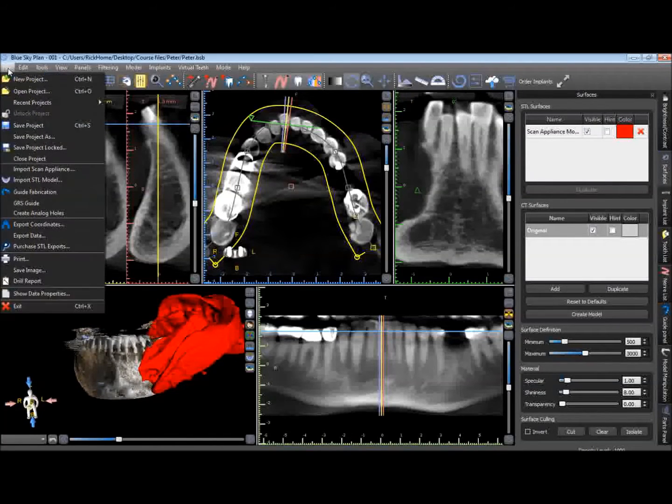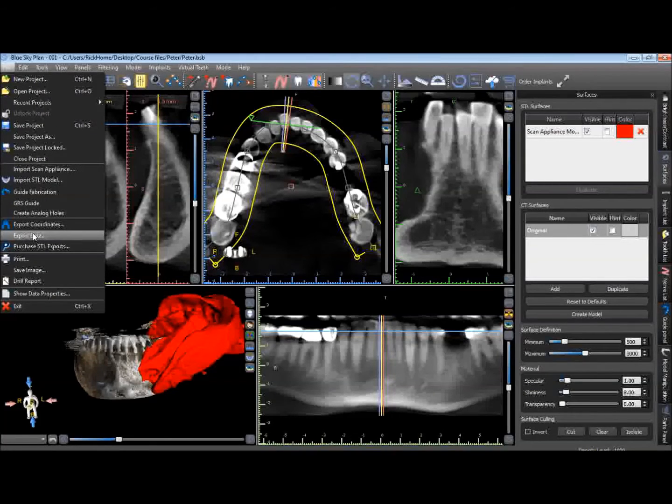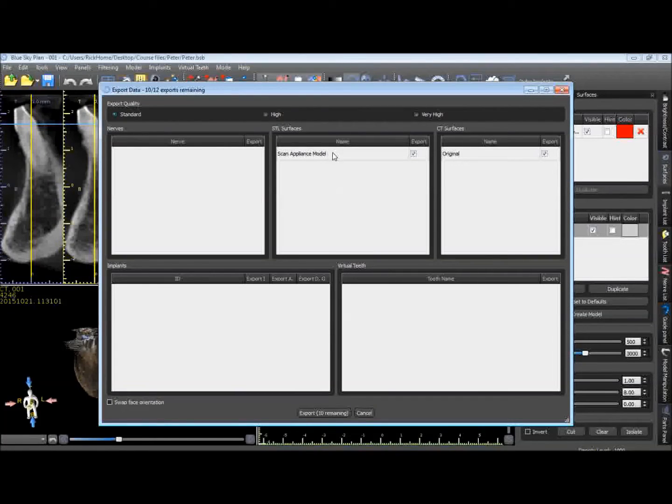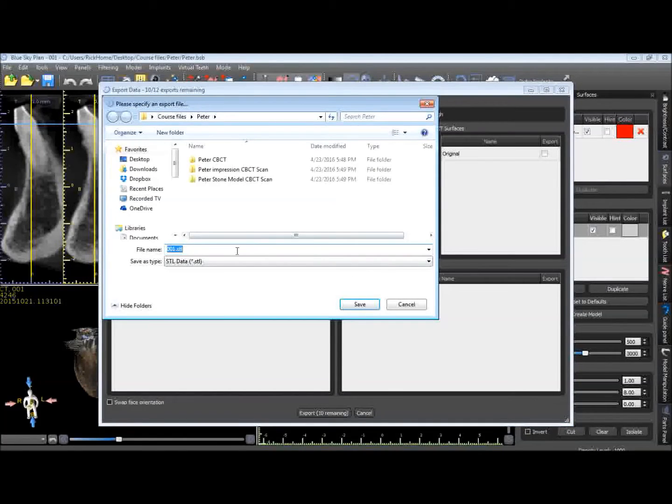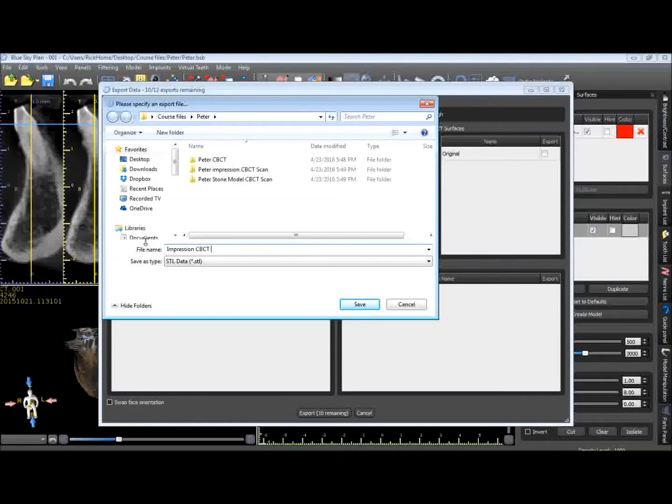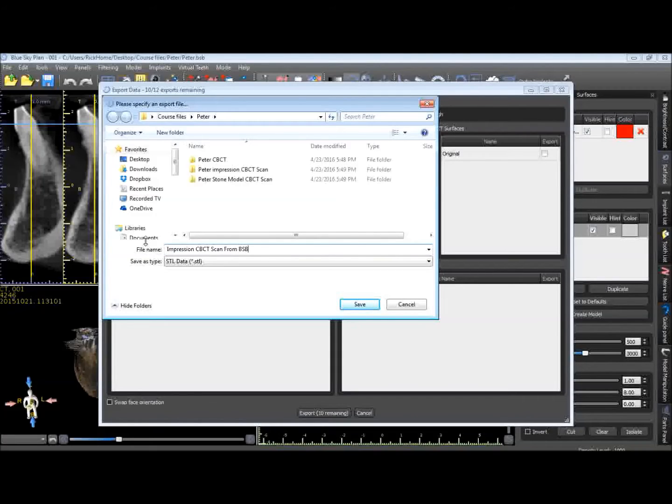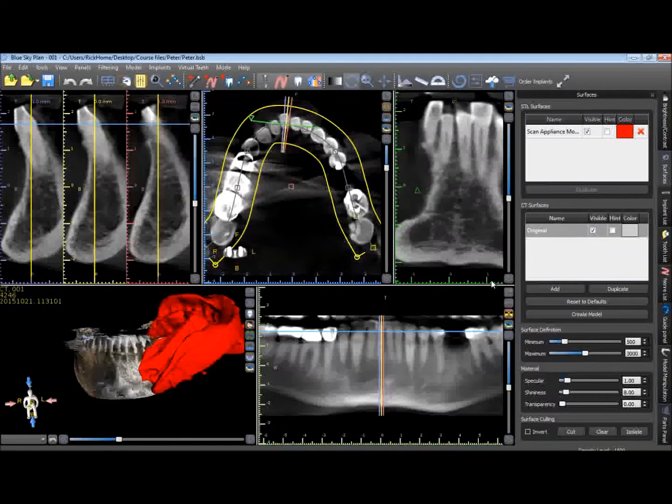We're now going to export this impression or scan appliance model out of Blue Sky. We're going to uncheck the original, that's the jaw scan, and go ahead and export that. And we're going to call this impression CBCT scan from Blue Sky file. So, we'll just give it a name, Impression CT scan, and we're going to save this as an STL file.